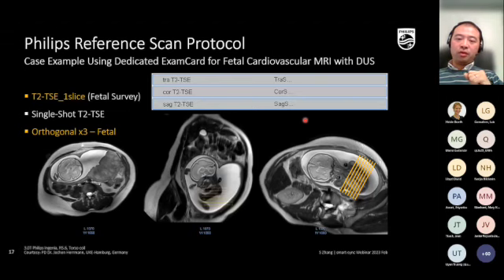And the beauty is, of course, the location of the slices will show up also in the other 3 directions. So you won't get lost in the anatomy or translation of the coordinates.